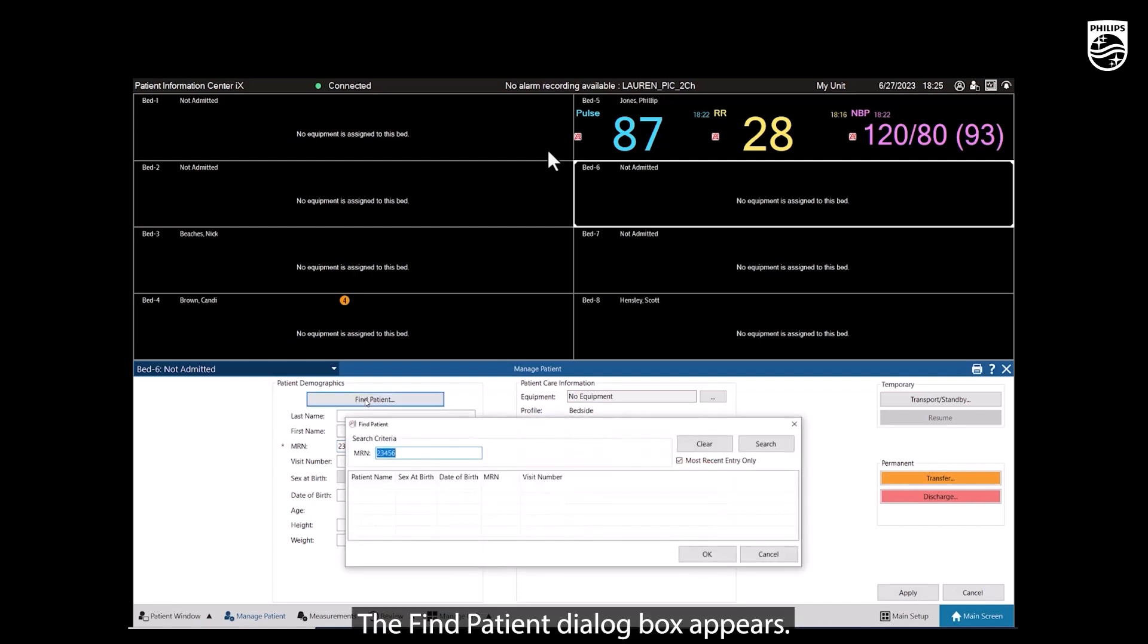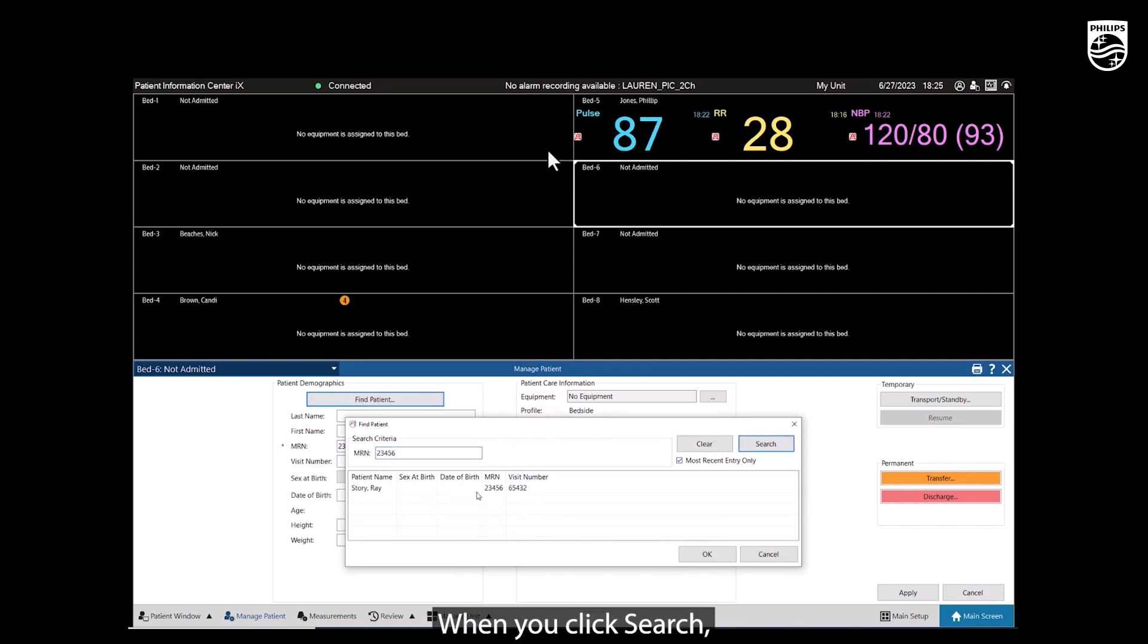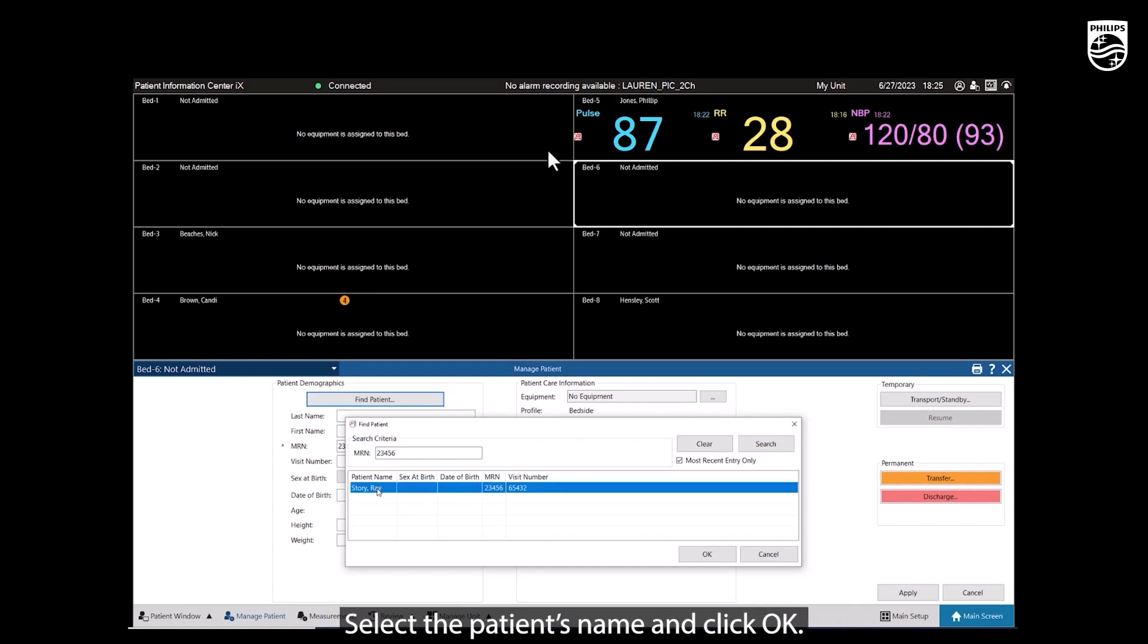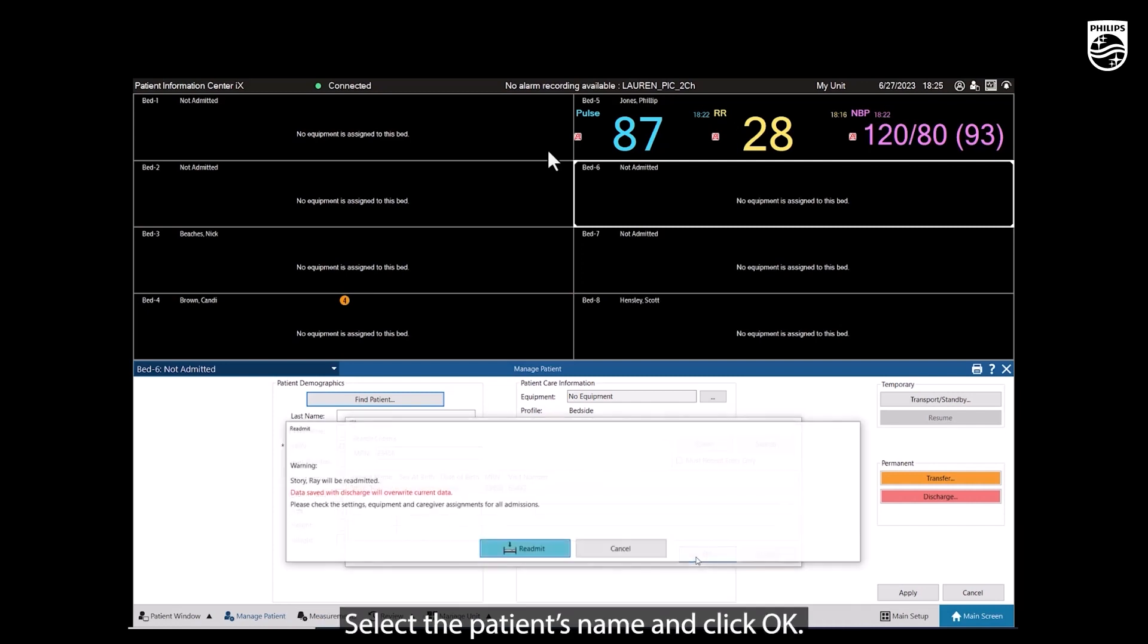The Find Patient dialog box appears. When you click Search, the name of the patient we discharged appears. Select the patient's name and click OK.